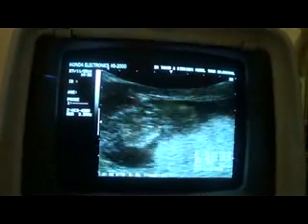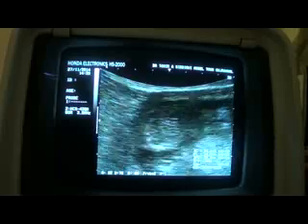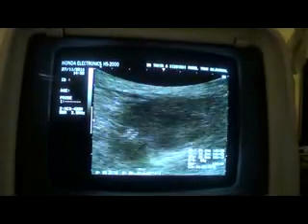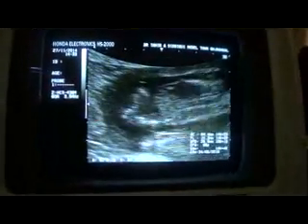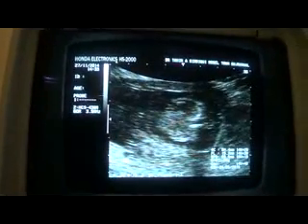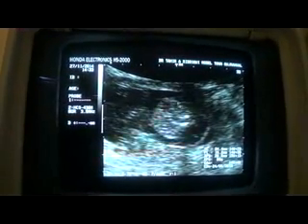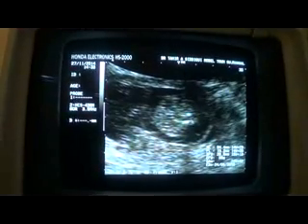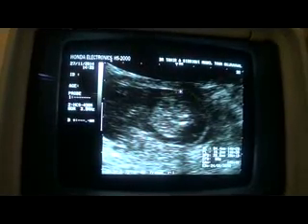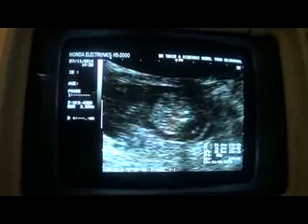So this is our case of the day with multiple fetal anomalies, with very poor survival rate. This is the edema around the neck, around the body of the fetus. This one. This is the body of the fetus in transverse section. This is the umbilical vein, and see that this is all edema, and this is the anterior skin of the fetus, filled with edema.